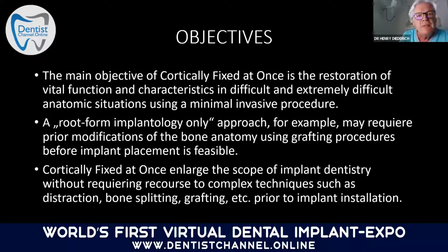The objective is the restoration of vital function and characteristics in difficult and extremely difficult anatomic situations using a minimal invasive procedure. A root form implantology only approach, for example, may require prior modifications of the bone anatomy using grafting procedures before implant placement is feasible.